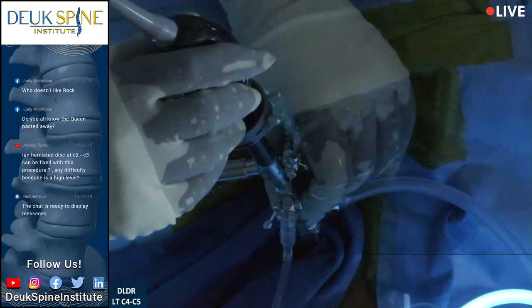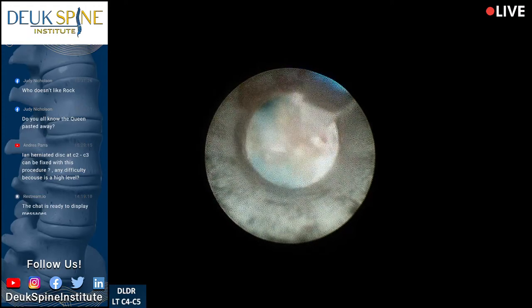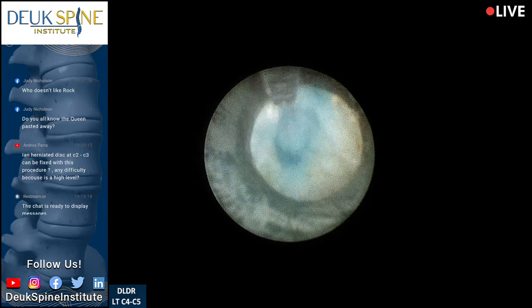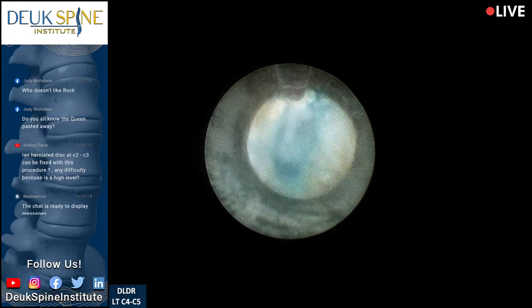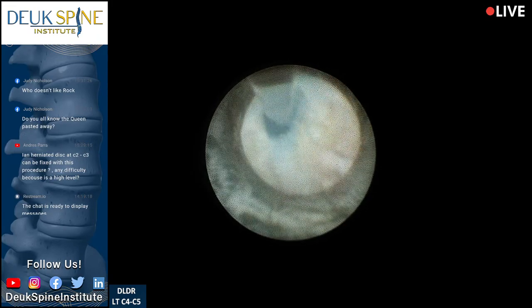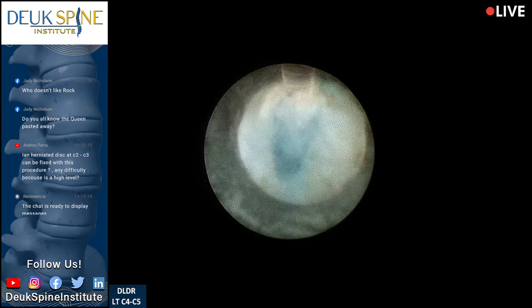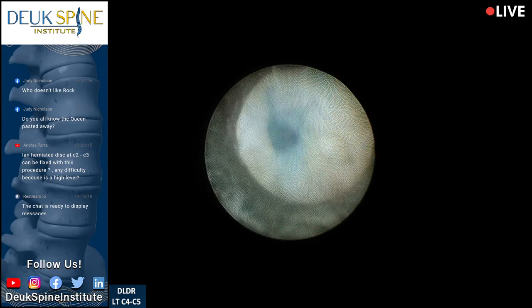It looks like there's still a little more in there, so we're going to get in and get to it. I didn't expect to see this honestly, based on her MRI — that's why you cannot trust an MRI. MRIs don't show you the details like you see with your eyes. That's a pretty good-sized herniation sitting on the spinal cord and the nerve on her right side — that's got to be why she's having all that pain.